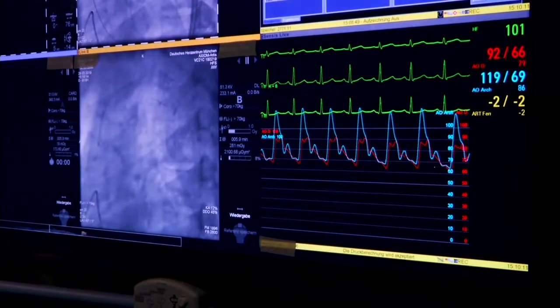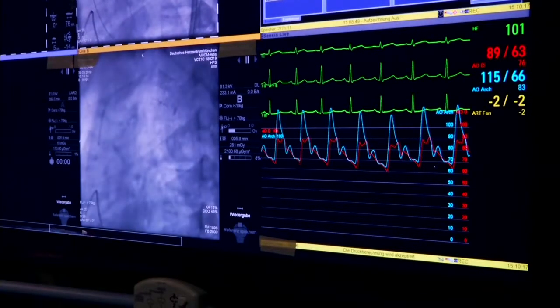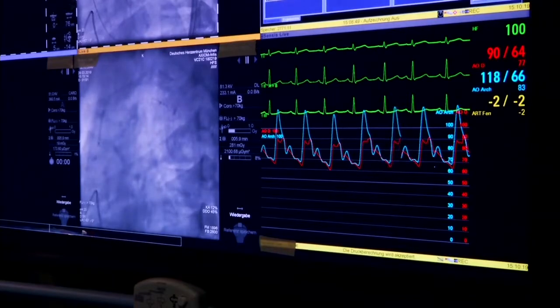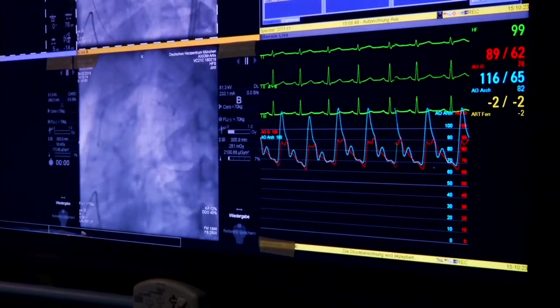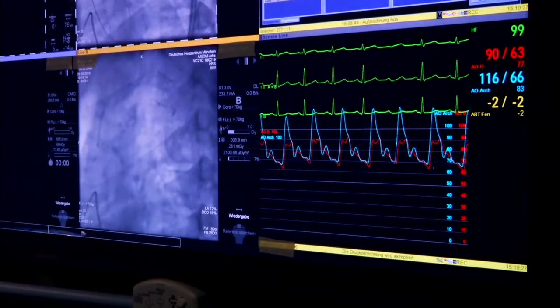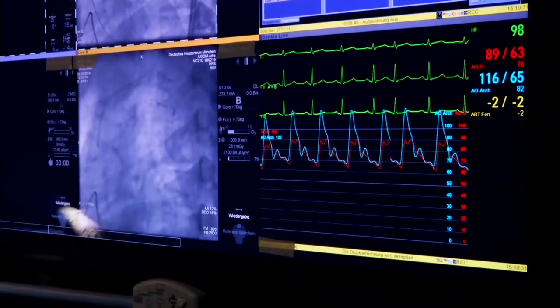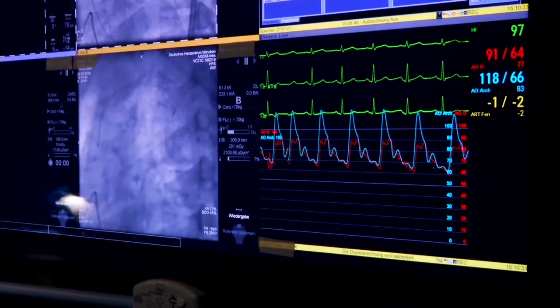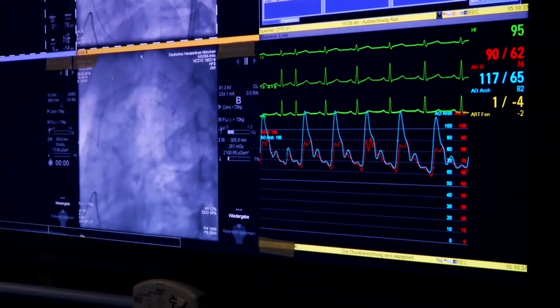It could be that the pressure is not high enough, given the fact that the stent we just implanted is in its distal portion smaller than in the entrance portion. So there is still some either recoil or not enough radial force. So Jackie is giving a very nice suggestion of flaring the first stent. No, I was thinking that the original stent doesn't really circumferentially cover that distal part of the transverse.